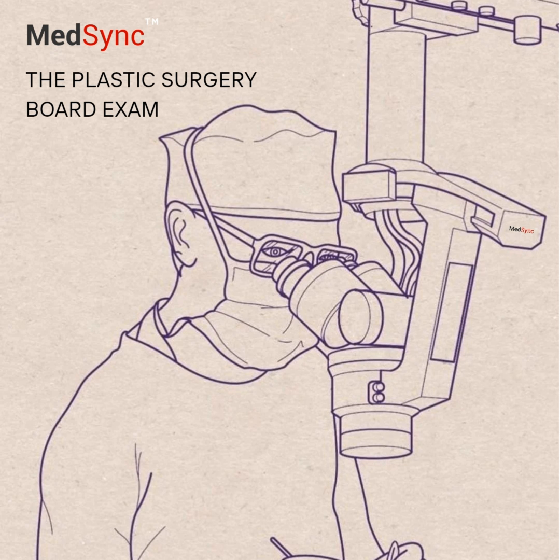Pressure sores and perineal wounds. Difficult areas. Very useful, especially after debridement, maybe treating underlying osteo if present. These wounds are tough to dress conventionally, high contamination risk. NPWT helps manage exudate and provides a closed environment. Getting a good seal can be the main challenge in the perineum.